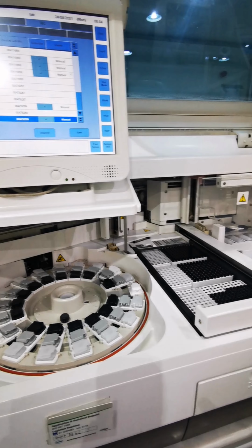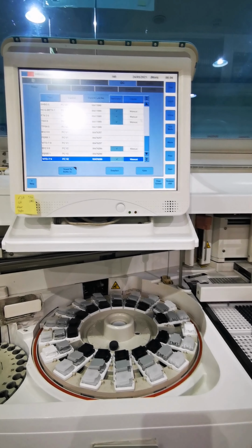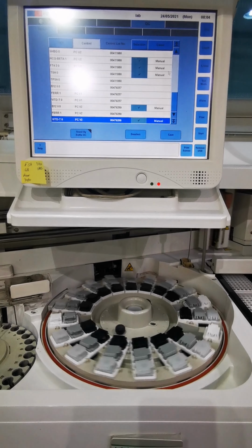With the machine being on standby mode, the machine is now initializing. The machine is now preparing for the control that we will test.